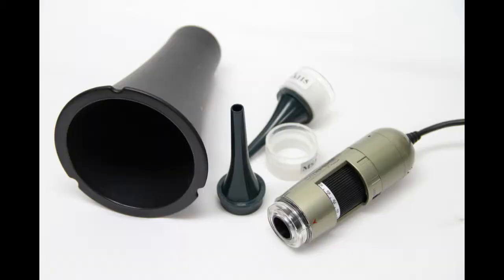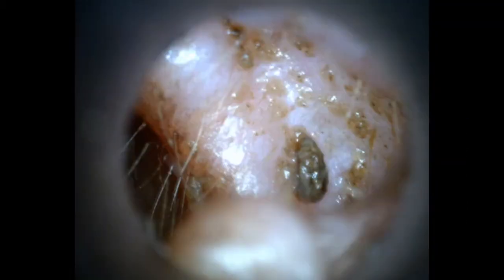With different sizes of ear specula available, the ADL series can be converted into an otoscope to check for wax buildup, ear mites, as well as infection.